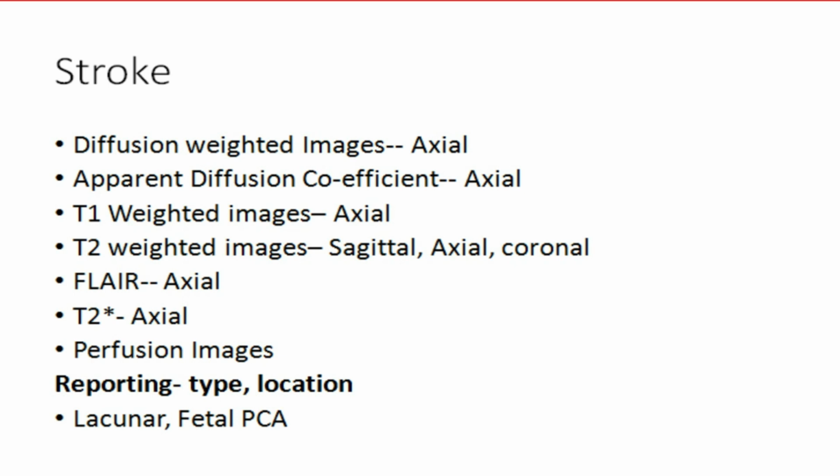Because if the DWI is not done, everything is messed up. Okay. But when you have this information, it really helps you decide the medicine of the patient. It helps you decide the next investigation of the patient. Do you really need a CTA? Do you need an echocardiogram or not? Okay. So these are very key points for any patient.